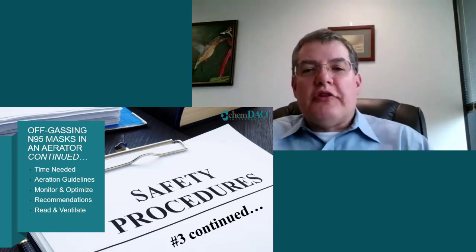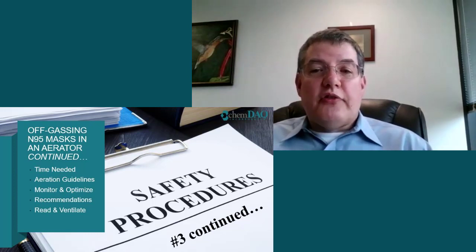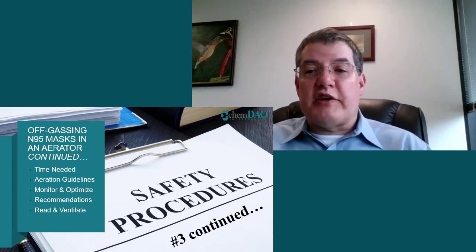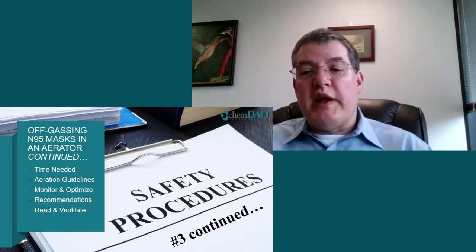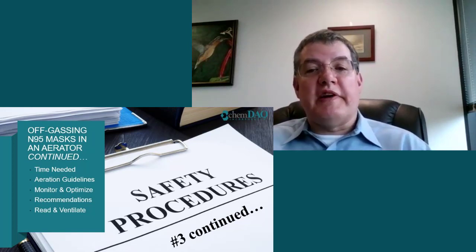At the moment, hydrogen peroxide looks like the most promising disinfectant chemical, but it is not the only chemical out there. And other methods using other disinfectant chemicals are also being developed. The prime candidates are those for which there are vapor generators already available for room disinfection, using compounds that do not leave any harmful residues, especially ozone, chlorine dioxide, and peracetic acid. If these chemicals are used, then the same issues concerning when it is safe to re-enter the room and determining the extent of off-gassing from the disinfected mask are the same.